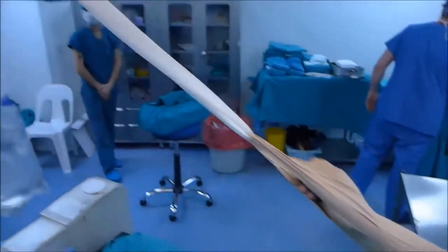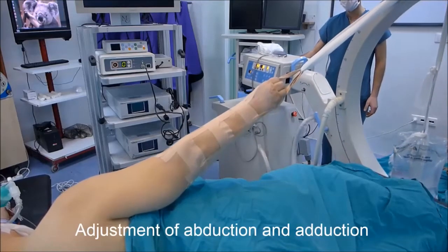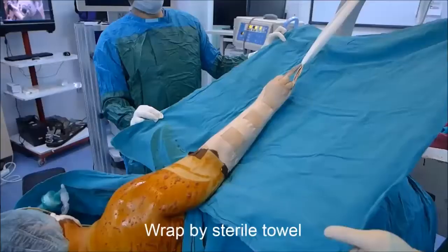The skin traction is tied to a rope or bandage passed over the upper arm of a C-arm fluoroscopy apparatus. Three to six kilograms of weight is attached to the rope or hanging around the C-arm. The amount of abduction and adduction can be adjusted by the elevator function of the C-arm device.